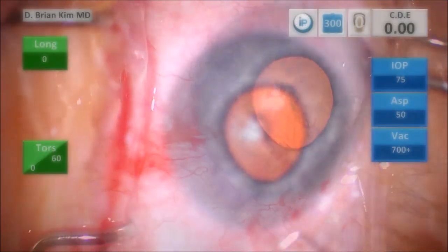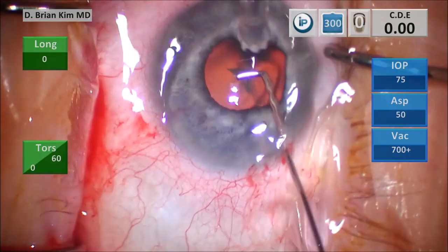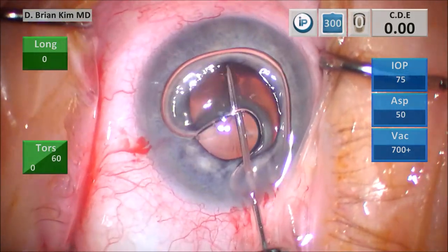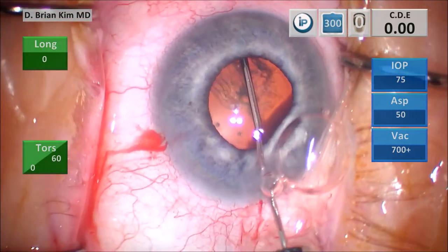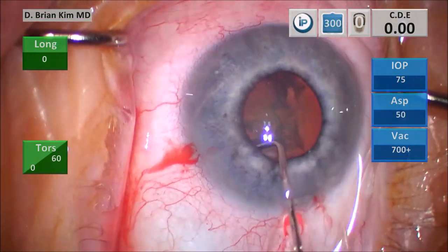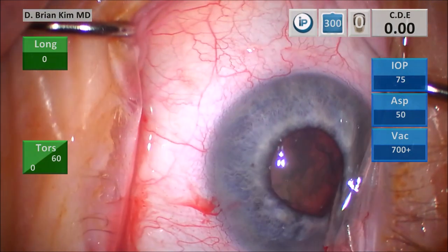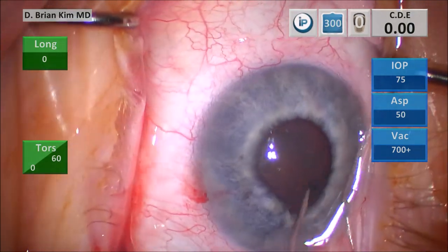I'm going to begin my capsular fornix hydrodissection technique. I place the cannula out flat to the contralateral equator underneath the anterior capsulorhexis edge out to the capsular fornix, turn the tip downward, and then you get a nice fluid wave. This pupil is very small, so you have to just trust your technique. I decompress on the left side and begin to spin the lens on the right side. I like to turn the tip slightly downward, which helps me engage the endonucleus edge and spin the lens.